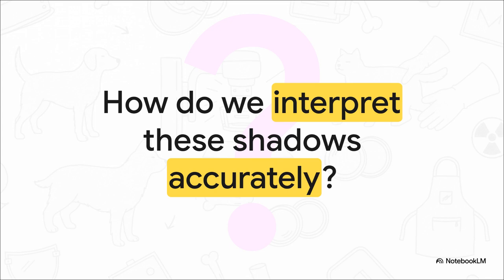A proper interpretation rests on 3 foundational pillars. You absolutely must have a comprehensive case history. You need a thorough physical examination of the animal. And, of course, a perfectly executed radiographic technique. If you're missing even one of those 3, the shadows remain exactly that, just shadows.